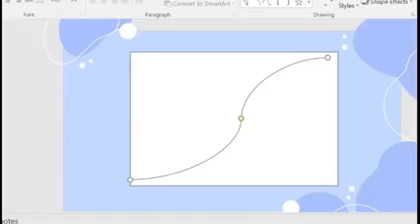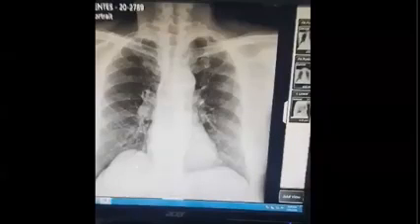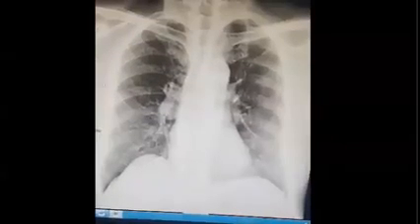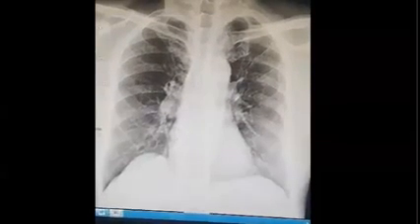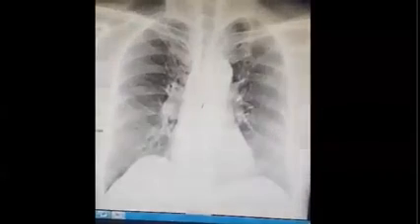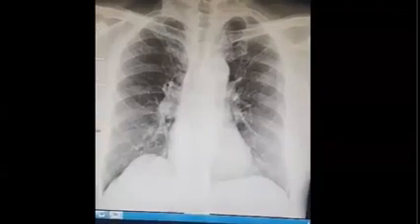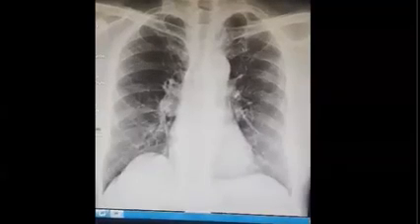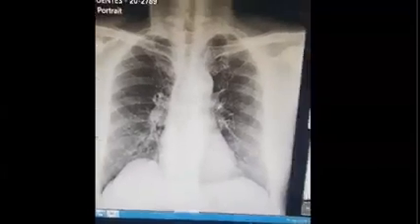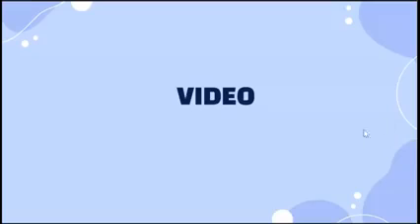Okay, and for example, I have another video here. Okay, so as you have seen in the video, diba, as I have maneuvered my mouse from up to down, the contrast was increased and decreased.